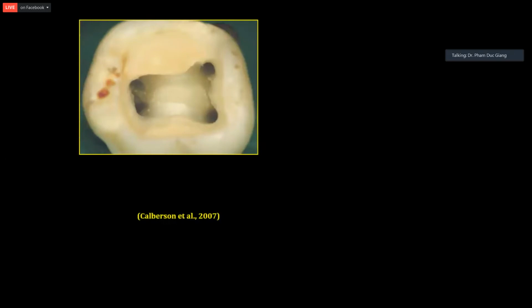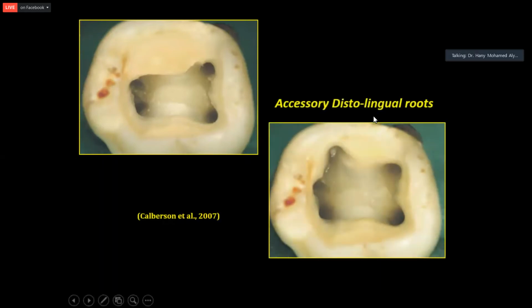Đây là hình ảnh giải phẫu ống tủy, hình ảnh cái xoang mở tủy của một cái răng hàm lớn hàm dưới, bạn hay thường gặp, trông thì nó có 2 ống tủy phía gần, 2 ống tủy phía xa. However, in the real situation, the access cavity should be extended to the distolingual because there is an additional root in this area. So this means an access cavity should be done properly in order to not miss any canal.